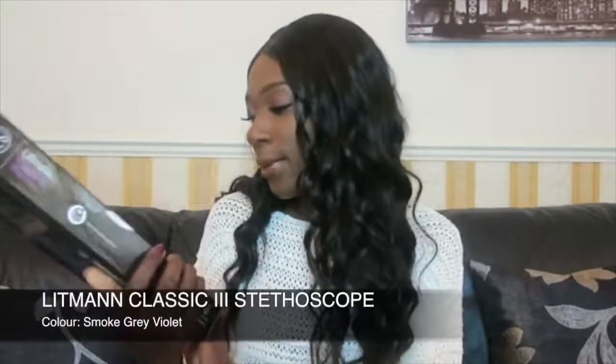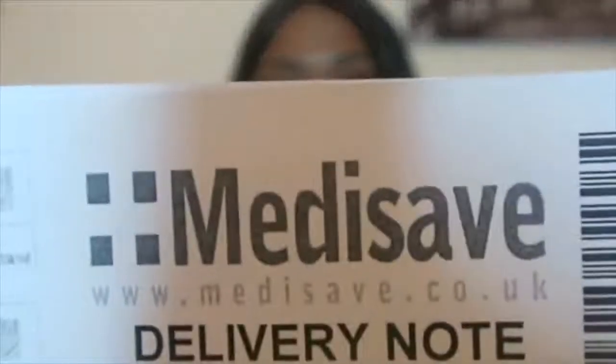I got this stethoscope about two months ago — the Littmann Classic III stethoscope. I've actually used this stethoscope for one of my OSCE exams, and it was actually pretty good. I went on the Littmann website first, and they had a link with several different websites where they sell stethoscopes. I decided to get mine from Medisave.